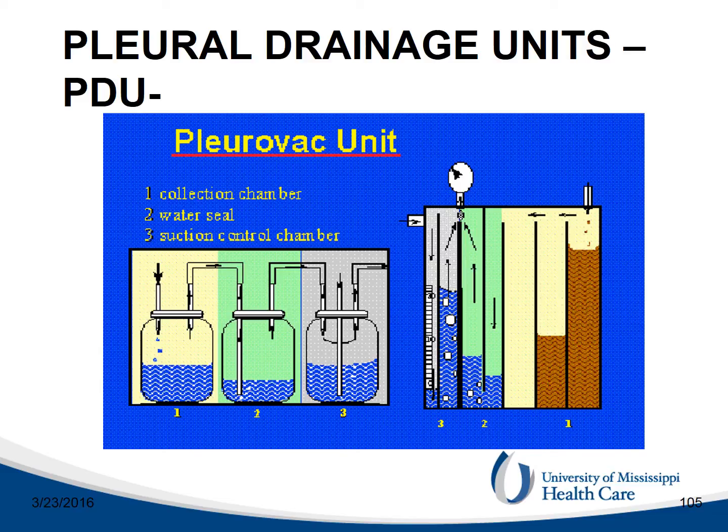On the right side of the drawing, you can see the same 3 barrel system in one single plastic unit. The 3 chambers are still communicating with each other inside the unit.